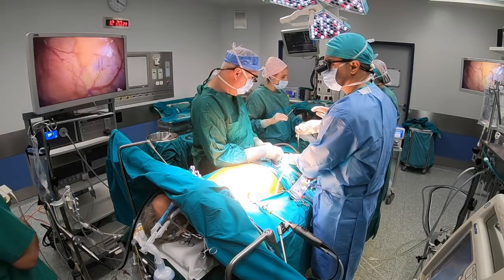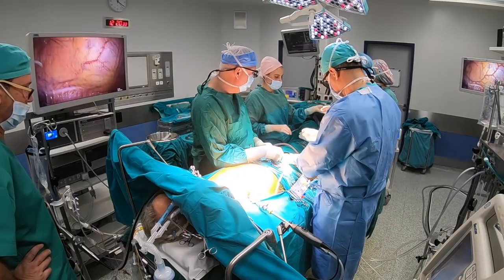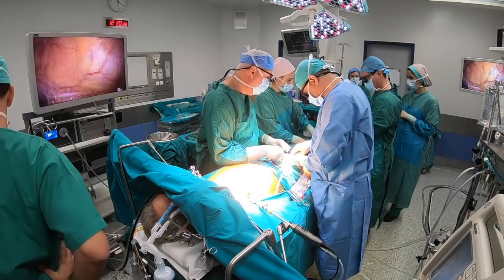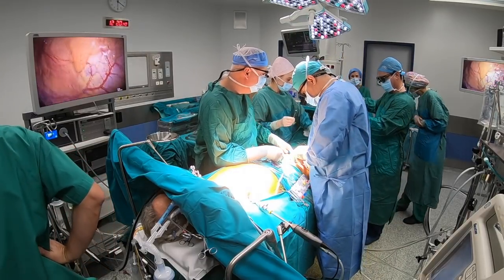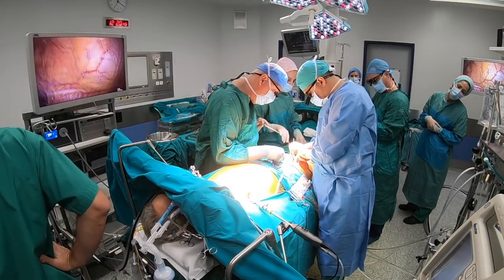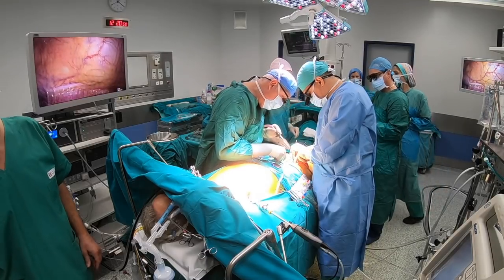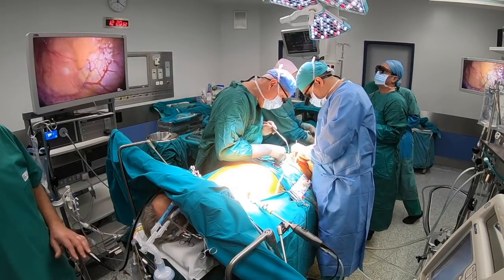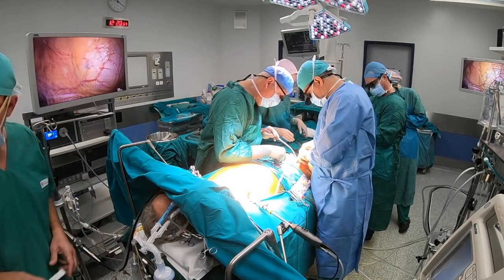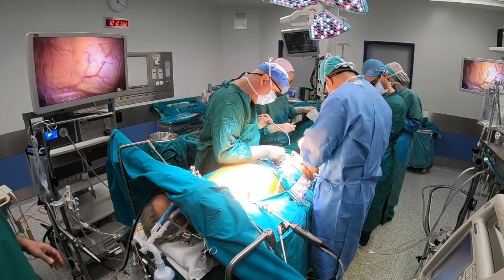We cannulate the femoral vessels using the Seldinger technique. We use a 21 to 25 French femoral Biomedicus cannula and also an 18 or 20 French EOPA arterial cannula, depending on patient size. For patients below 2.2 square meter surface area, we use the 18 French EOPA arterial cannula, and for larger patients the 20 French EOPA arterial cannula.